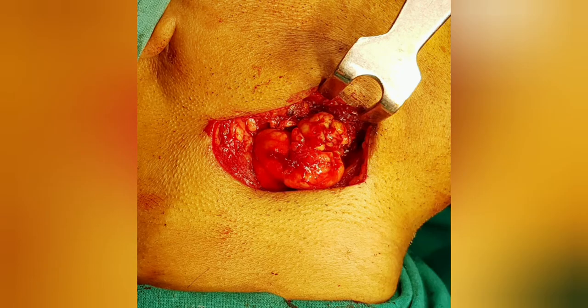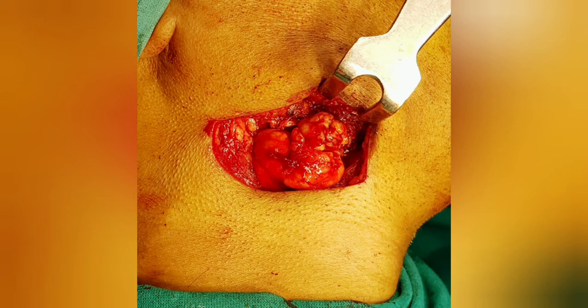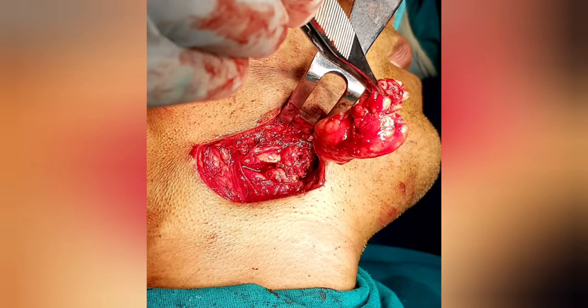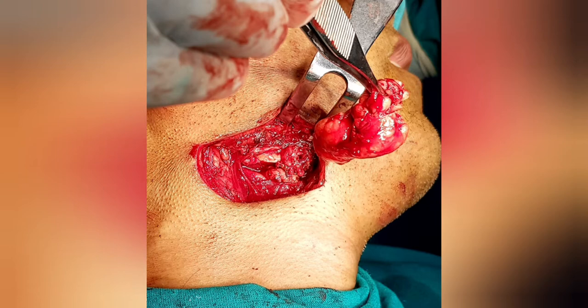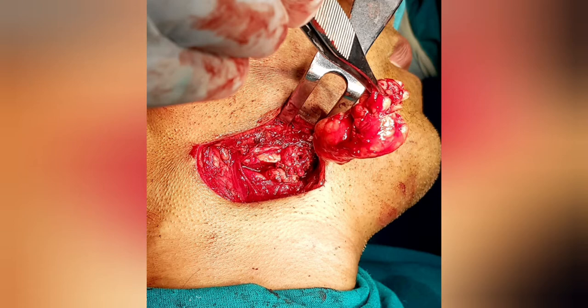The incision was given to reflect the flap, and after reflection we reached the mandible towards the pathological side. Once we reflected the flap, we found a node at the Level 1b region. We removed the Level 1b lymph node. This picture is showing the removal of that Level 1b node, which was a quite large node as found here.